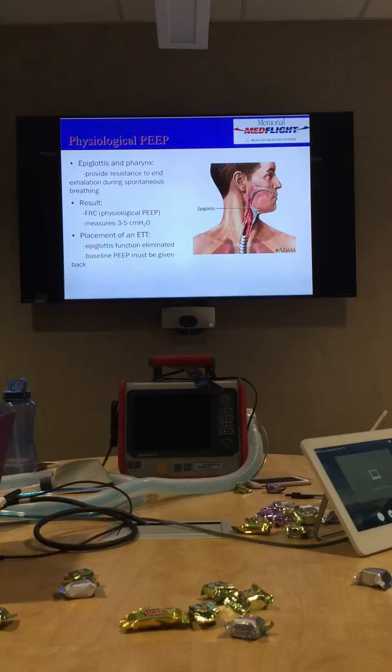I've been higher. I've seen 20. Yeah, which makes us really nervous because we've been taught you don't go above 7 or 8. For us, 8 used to be high, and now we're seeing these high PEEPs coming. So just be aware that it's not uncommon, especially pulling them out of our ICU, that they may have them, and I've seen it other places as well.